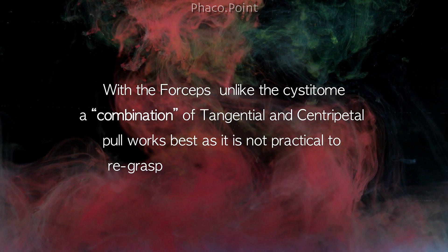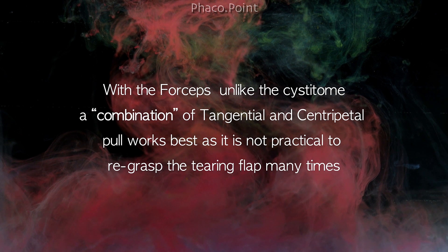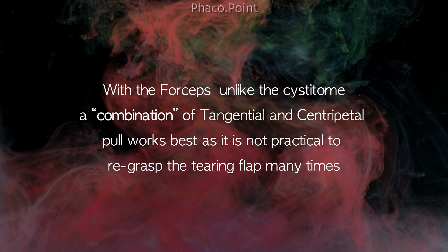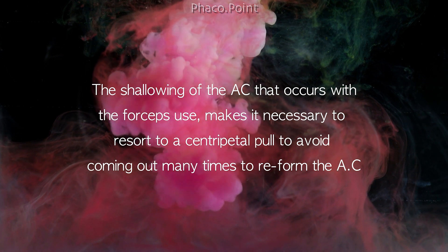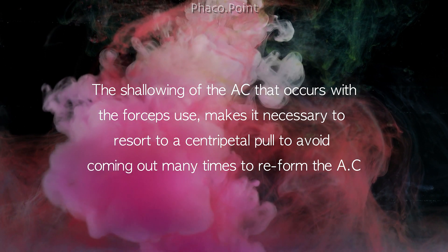When we use the forceps, unlike the cystotome, we need to use a combination of both the tangential and centripetal pull, as it is not practical to re-grasp the tearing flap many times with forceps. Also, the shallowing of the chamber that occurs with forceps makes it necessary to resort to a centripetal pull to avoid coming out many times to reform the anterior chamber.